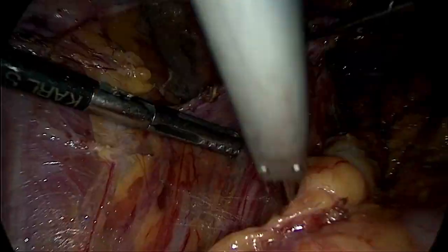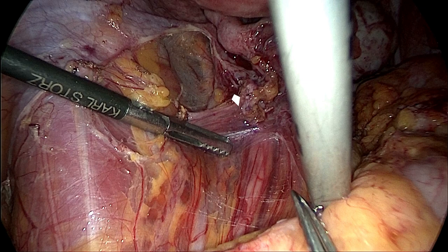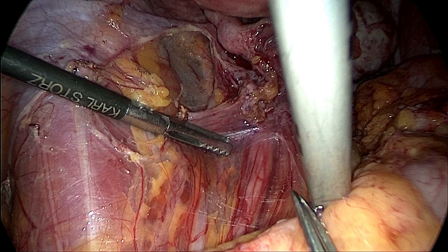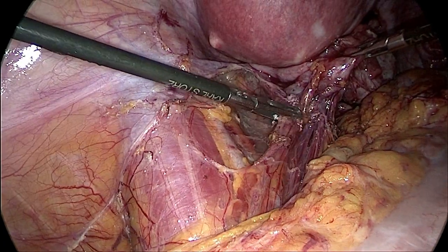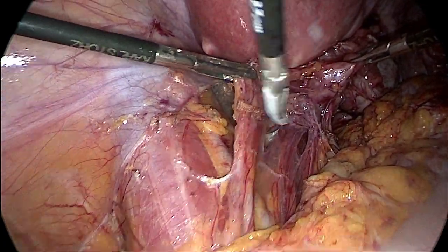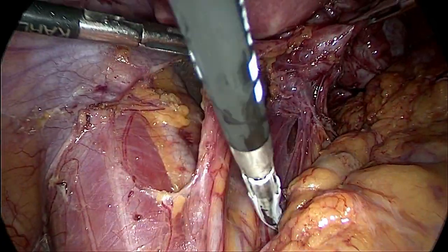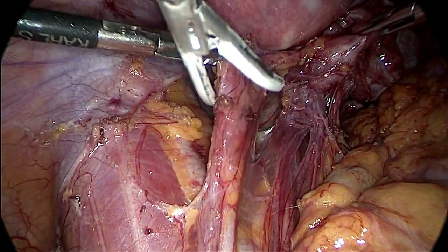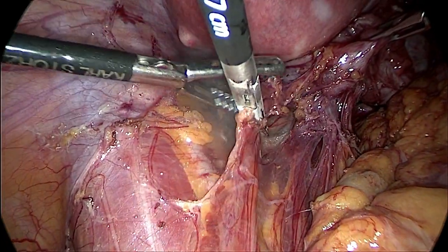The left ureter was anatomically identified by laparoscopic vision. Ureterolysis was then performed to avoid injuries during the procedure.